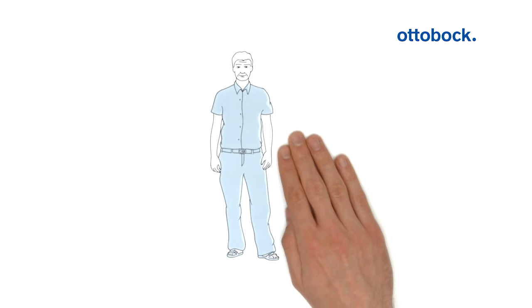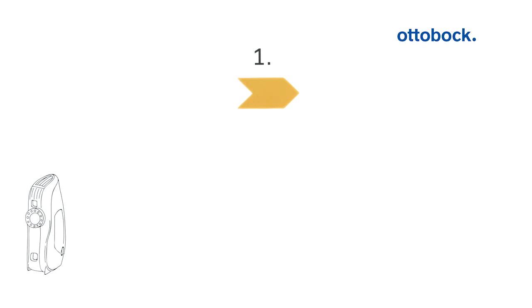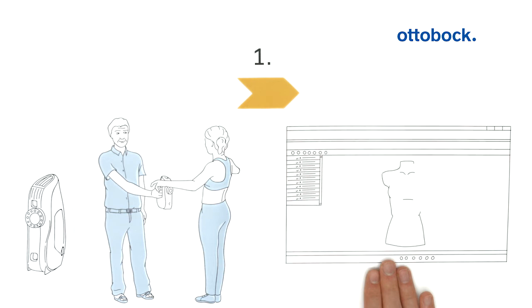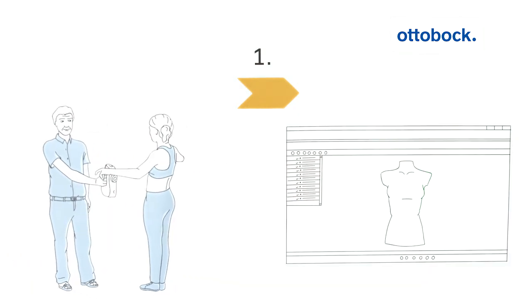Let us join Peter, an orthopedic technician, in this process. In a first step, he digitizes the patient's body part using a handheld 3D scanner. He directs the scanner to the area to be modeled. The screen shows him in real time which parts have already been recorded and which still have to be scanned.